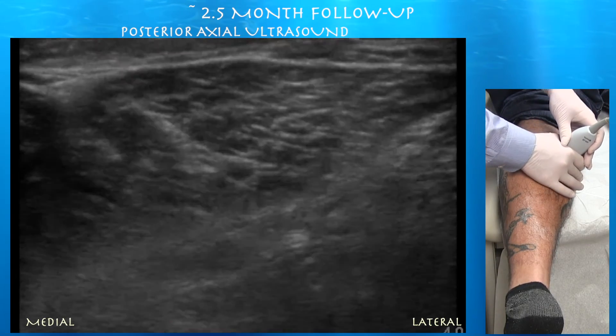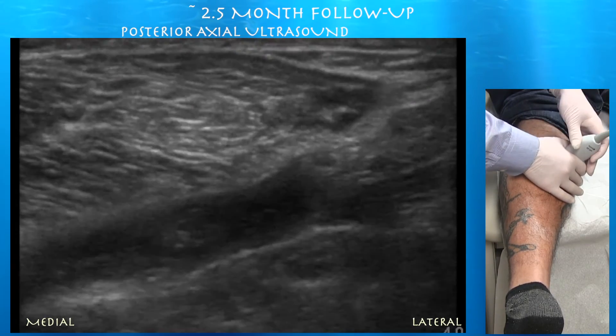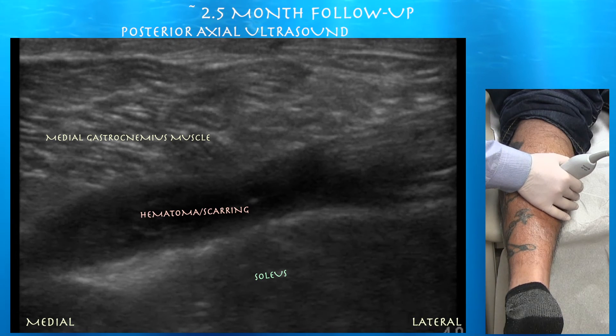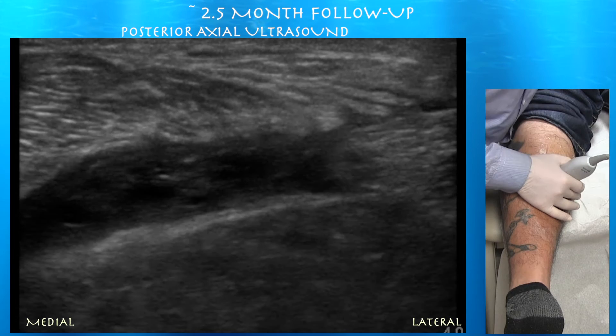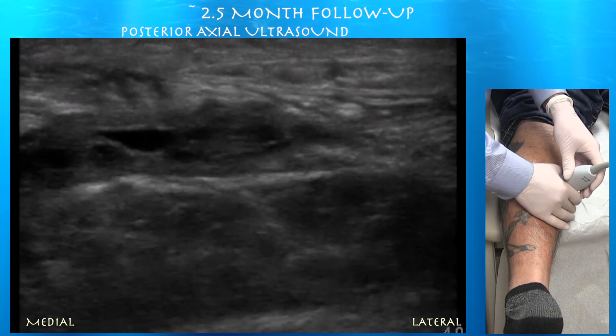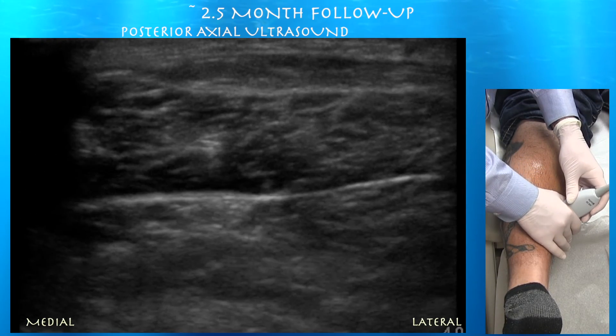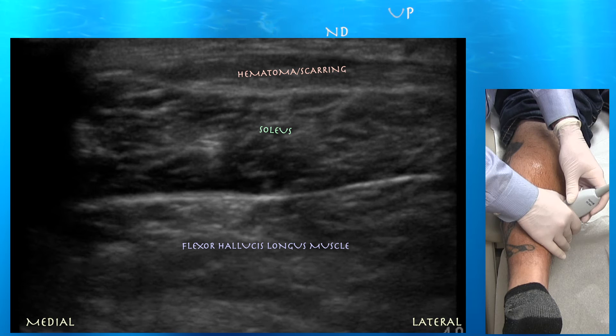You can see that fluid collection underneath the medial gastrocnemius muscle, between that and the soleus. On axial plane the hematoma is essentially just under the medial gastrocnemius muscle between that and the soleus. Continuing distally and centering the hematoma — you can see it's organizing. The hematoma is hyperechoic in some parts and anechoic in others, but overall it is organizing itself.